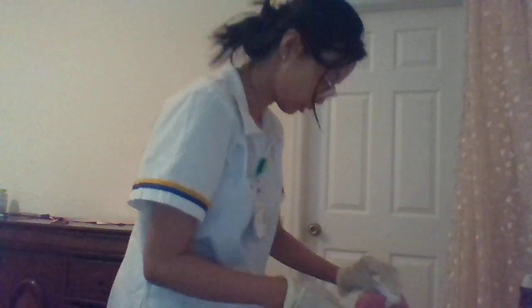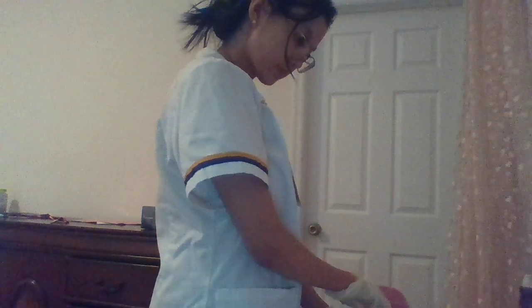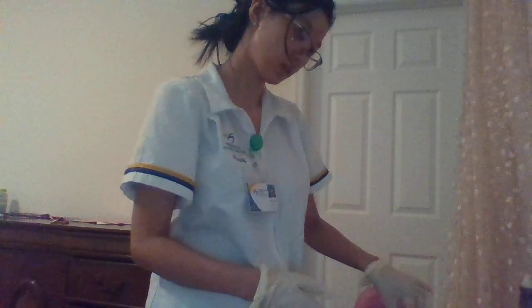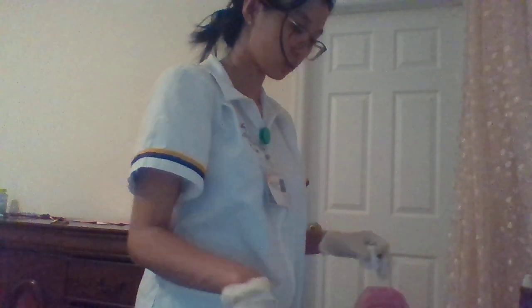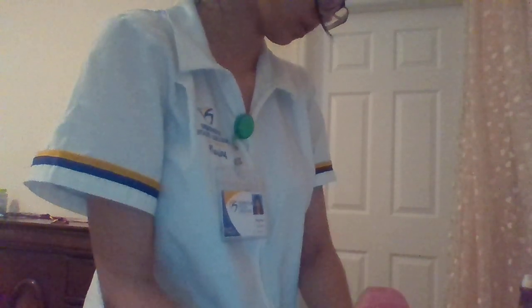And I am gonna use the gauze to apply gentle pressure on the injection site. And I'm not gonna massage it. And after that I'm gonna clean everything and then remove my gloves.